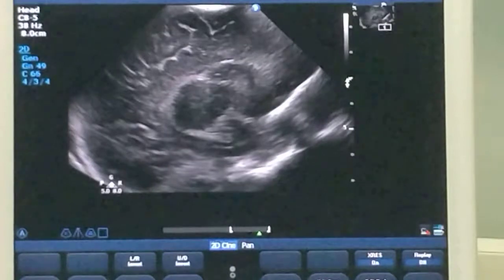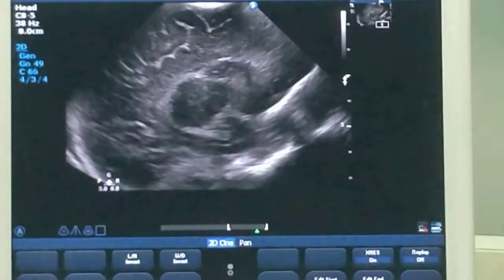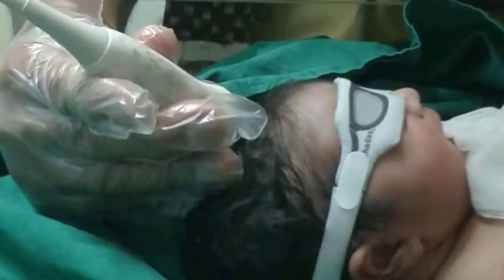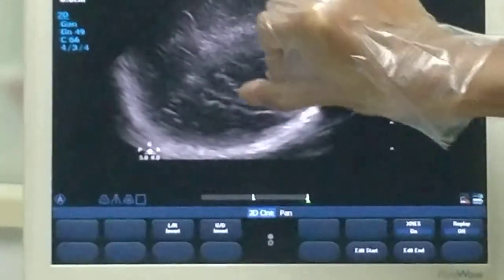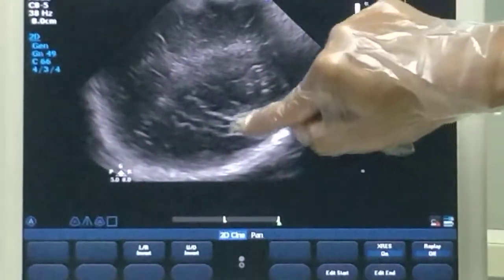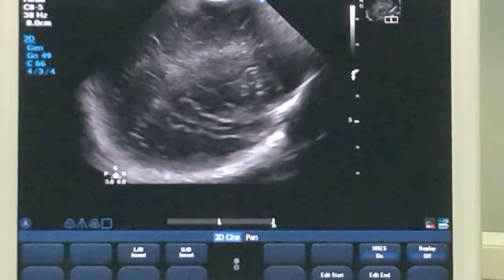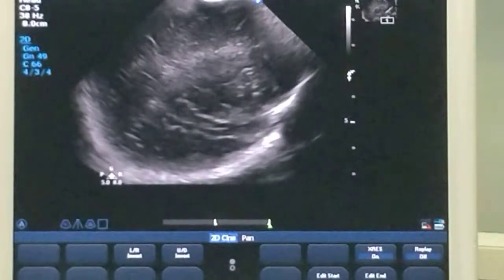If I move this probe still more laterally, this is the parasagittal view. Moving further laterally, you appreciate a structure in the temporal lobe called the insula. The whole island is called the insula, and what you see here is the middle cerebral artery — a hyperechogenic structure. This is seen in what is called the tangential view. So in the sagittal view you have the mid-sagittal, sagittal, and tangential planes, and the same can be repeated on the other side.